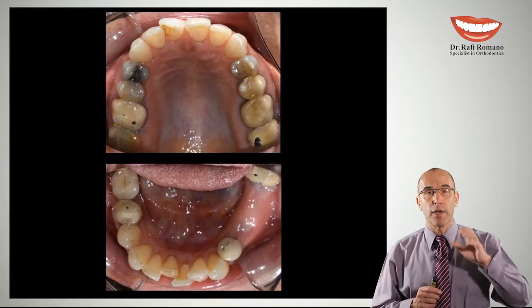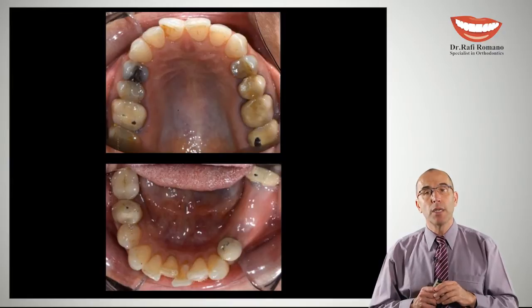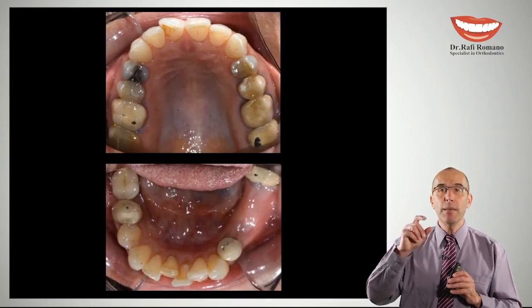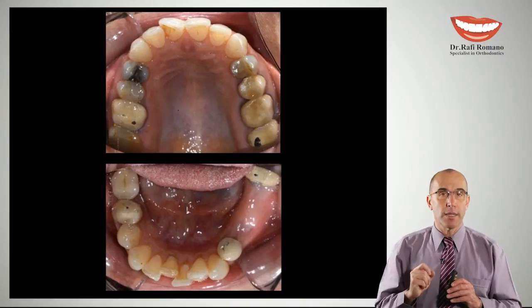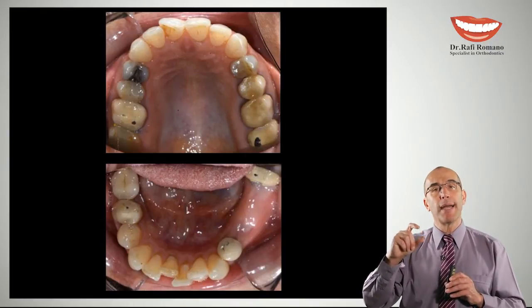These are the occlusal photos of the upper and lower arches. You can see the overlap. You can see that she already has implants, as you will see in the X-ray, placed on the posterior left segment, and this was already determined by her doctors.